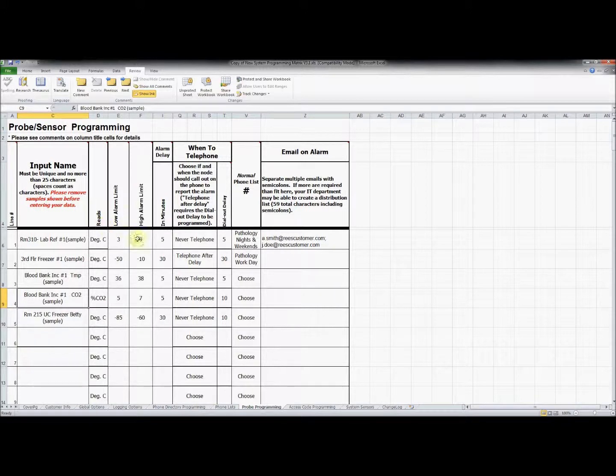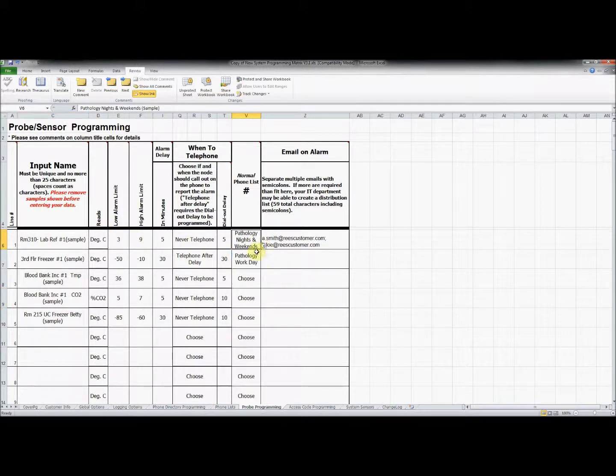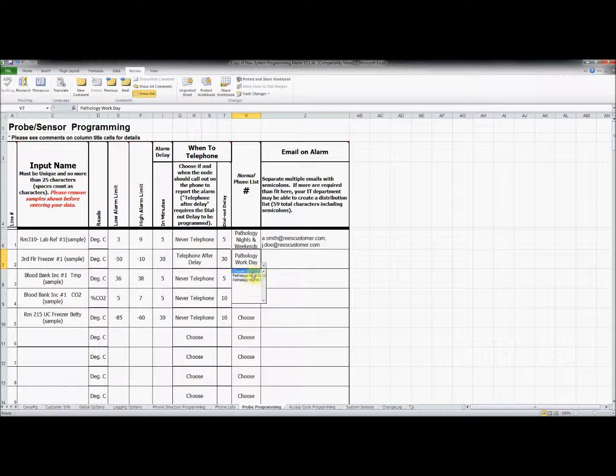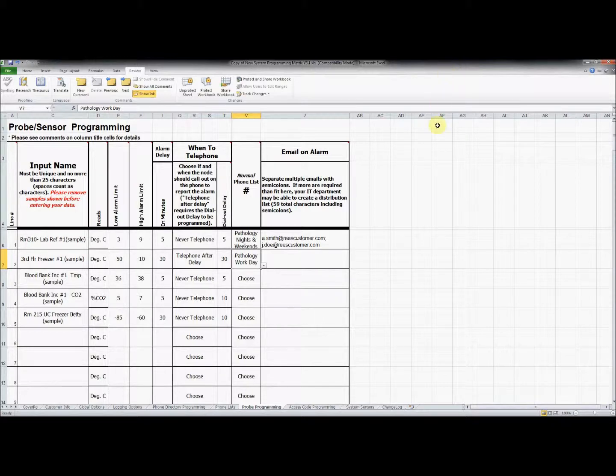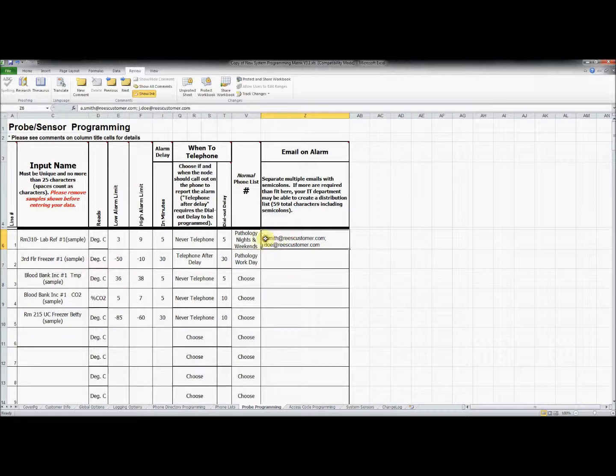Select one of the phone lists you made in the last tab from the drop down menu if you wish to use the phone notification system. In addition to or in place of the phone list, you can add email addresses in the last column for alarm notifications. Remember to separate addresses with a semicolon.